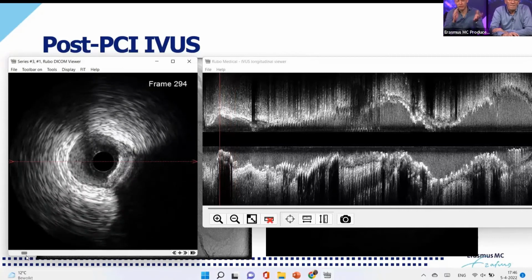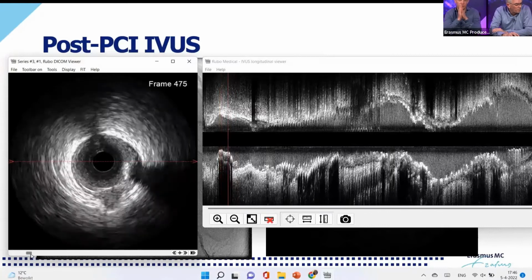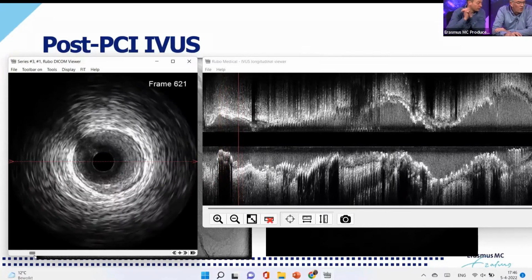And these catheters actually have a hybrid imaging technology that adjusts between 40 and 60, giving you the best of both worlds. So 60 for the near field and 40 for the far field. So also in larger vessels, you benefit from the penetration depth of a 40 megahertz catheter. At least that's how I always understood it. Jürgen, any comments? No, that's correct.